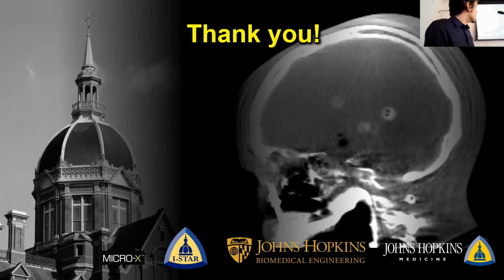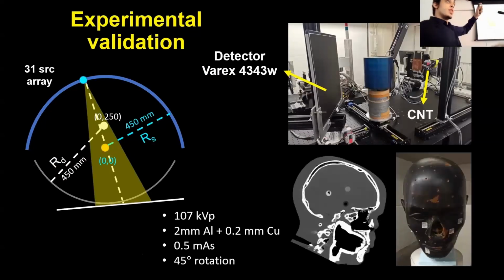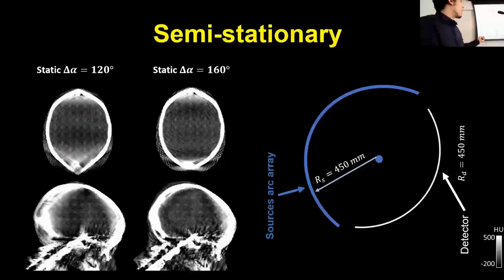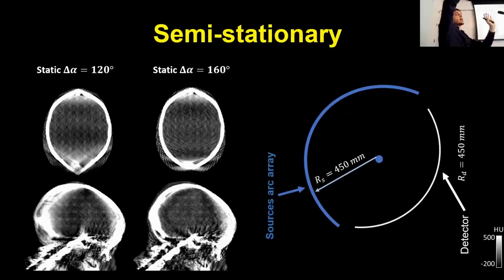Thank you. It's a good question. Actually, we are rotating the entire system, the sources together with the detector. So the sources are always in the same position with respect to the detector, but the volume itself is fixed. So we are seeing different regions of the volume with each source, but with respect to the detector, it's going to be the same. So in terms of uniformity of sampling, it's going to have good properties, but we're going to see different regions of the brain.